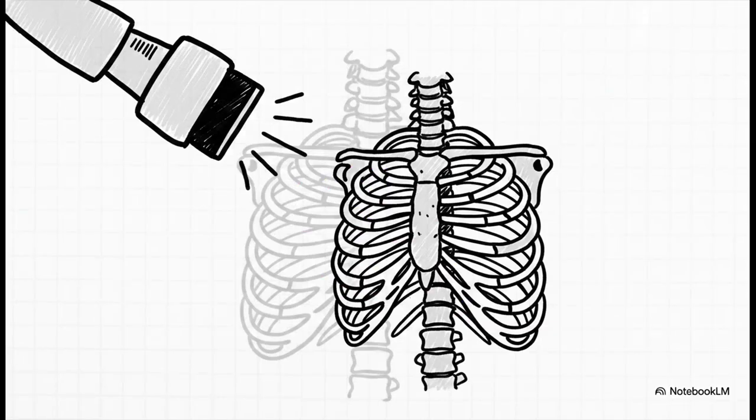So why so close? Usually, in radiography, we want a longer distance for a sharper image, but here we're totally flipping the script. Bringing it into a 30-inch SID intentionally creates geometric unsharpness for the structures furthest from the receptor. It literally blurs out those posterior ribs that are in the way, which actually magnifies and increases the detail of the sternum itself. It's basically a highly specific hack to melt away visual distractions.